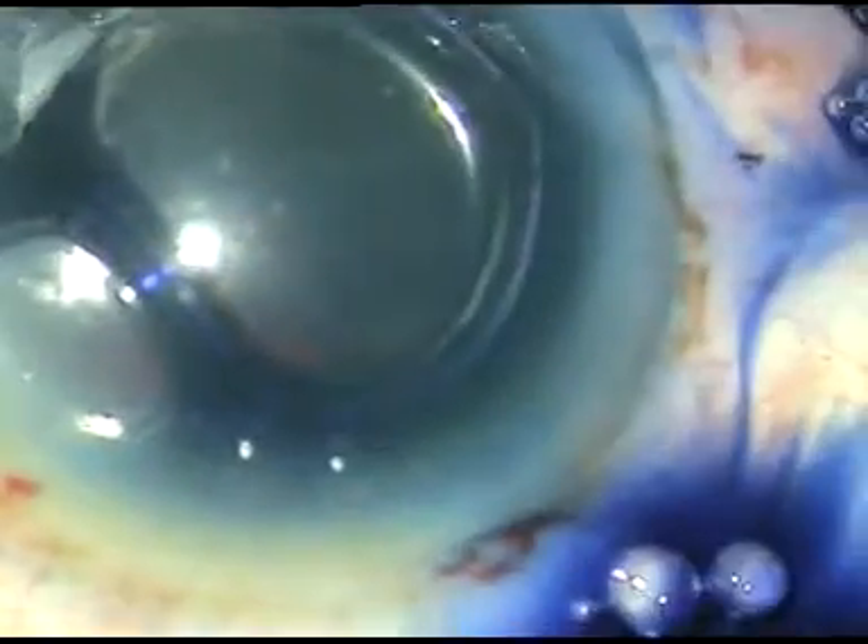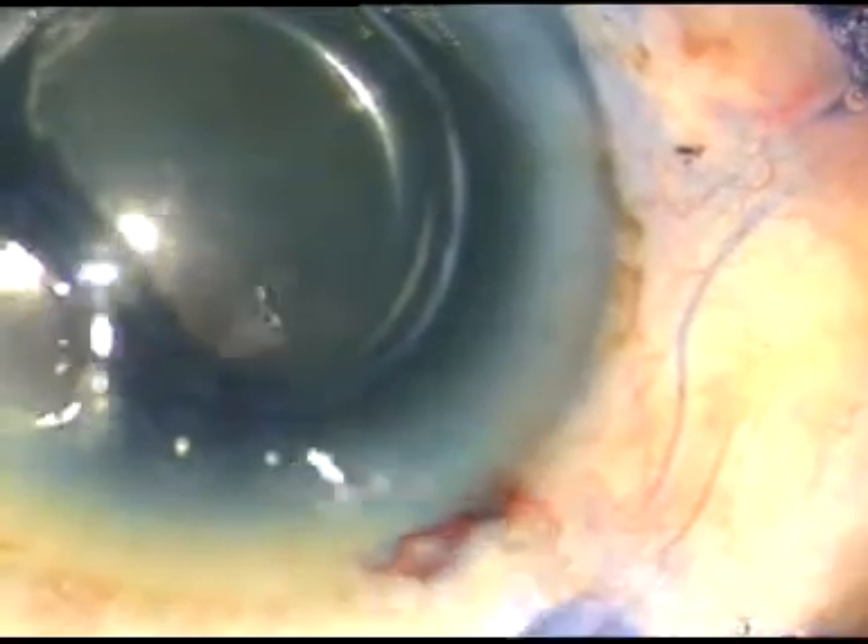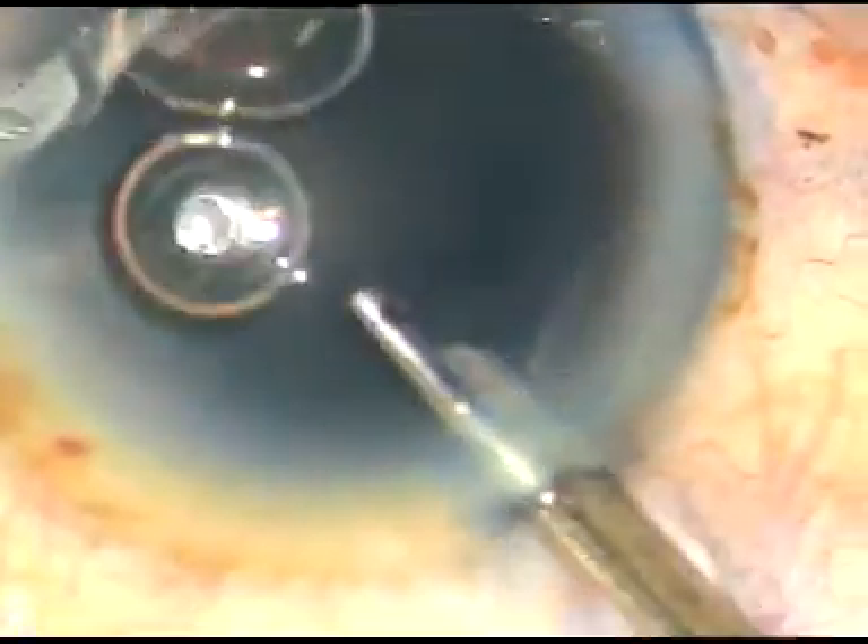Dear colleagues, the purpose of this video is to show capsulorhexis, hydrodissection, and safe nucleus management in this hard cataract.